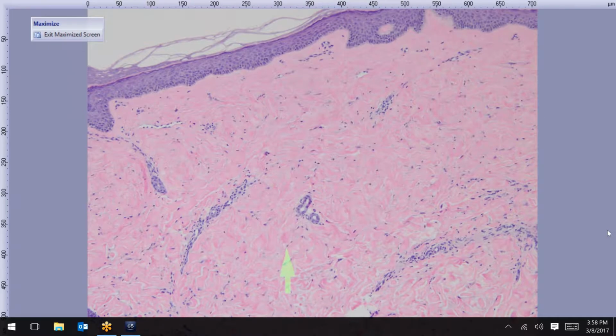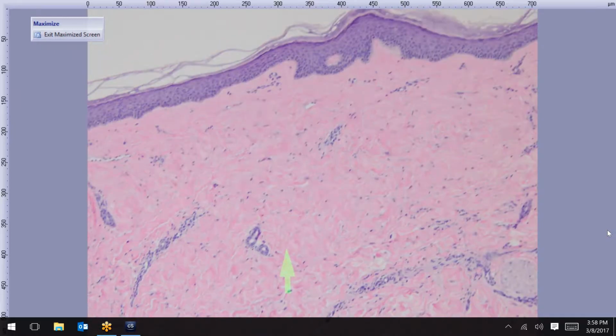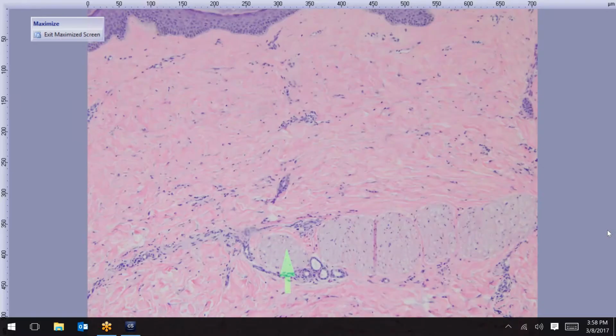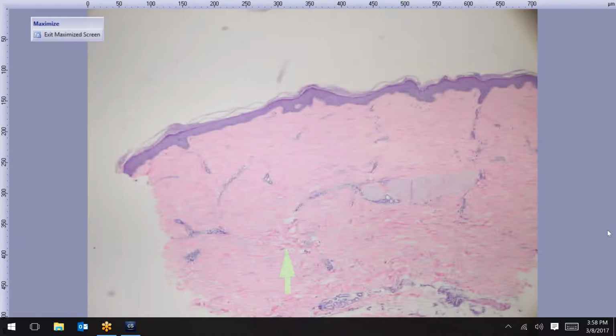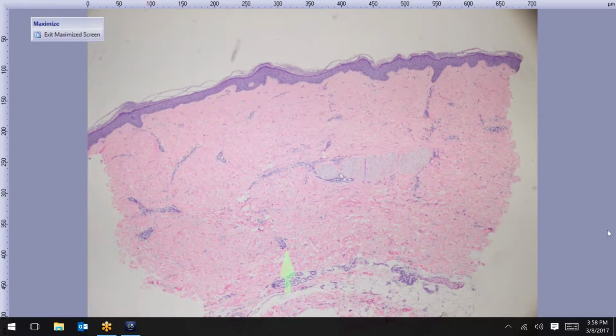So you can see, somebody said scar. That's one thought. You see these fibrotic areas here, maybe with a little vascular prominence. And morphea, yeah. So somebody else said morphea, and morphea is right. Even at this power, I think you can appreciate that it's a somewhat square biopsy. The other thing is that there are just not that many appendages.